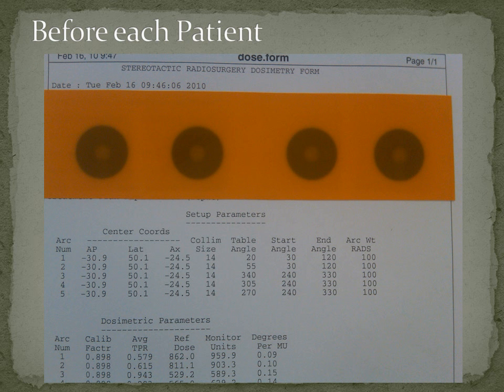Okay. Prior to every treatment, just like in the OR, where you take out the stereotactic phantom base and you make sure everything is correct before you put that probe onto the patient, we have a similar process in radiosurgery where we actually take the phantom base, we dial in the actual coordinate of the patient, we take that coordinate system, put it actually onto the accelerator, and then from all different angles, we rotate the patient, we rotate the machine, and we shoot films, making sure that the target stays in the exact center of the radiation field, proving to us that from one end of the treatment to the other end of the treatment, everything is still rigid and correct. And we do this prior to every treatment.